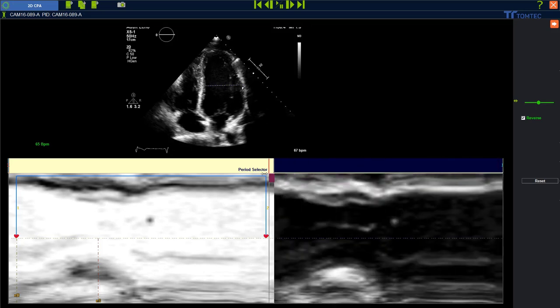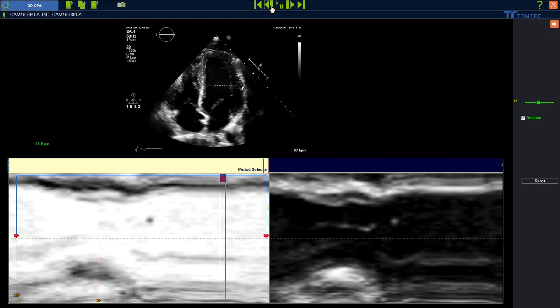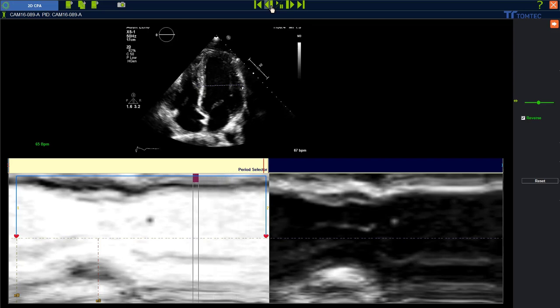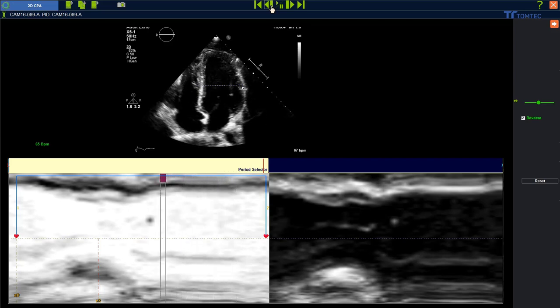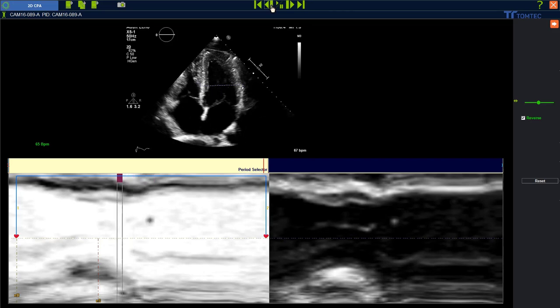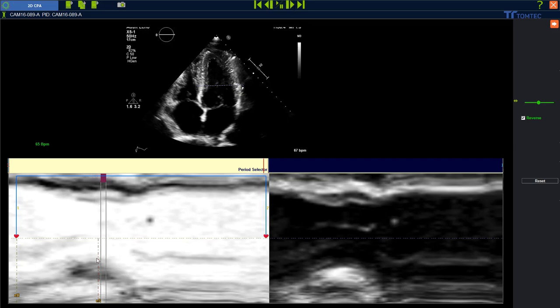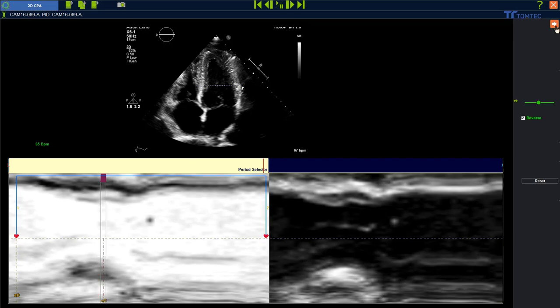With a right mouse click I can exclude the third R wave. Then drag and drop the red markers to exclude the second beat. Finally, double check the end systolic phase information to measure the strain in the correct phase of the ECG. Adjust it, then exit and confirm.